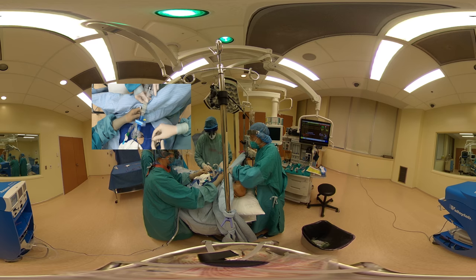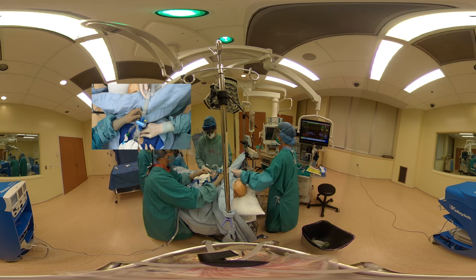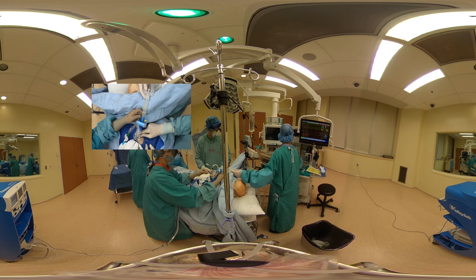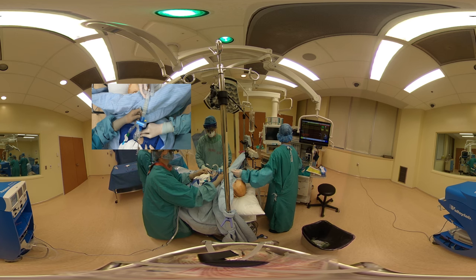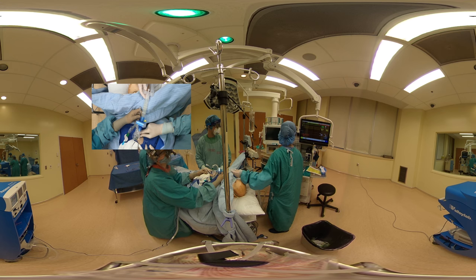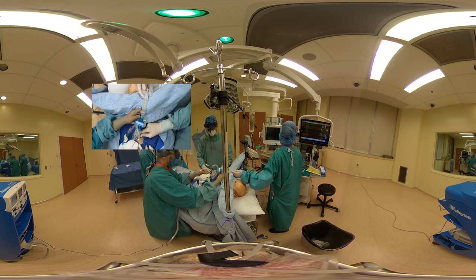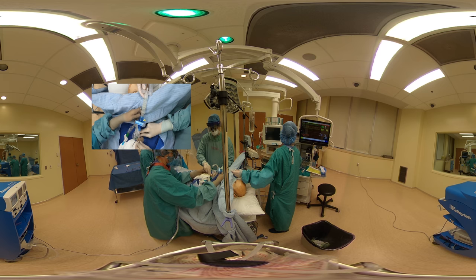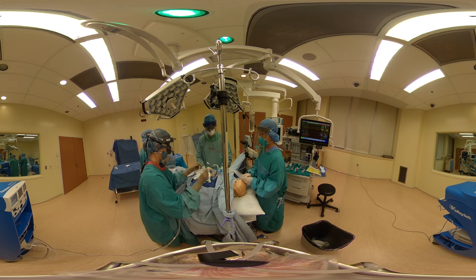Confirming that the cuff is fully inflated — yes, fully inflated. I'm going to turn on the ventilator now. The ventilator is on. And we have ETCO2. We'll now secure the tube with sutures and also with a Velcro trach tie.